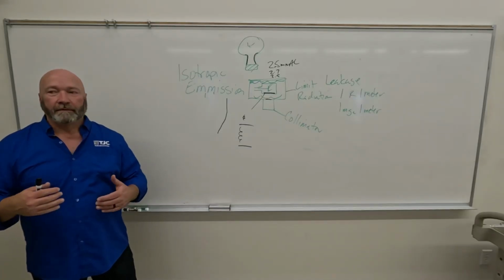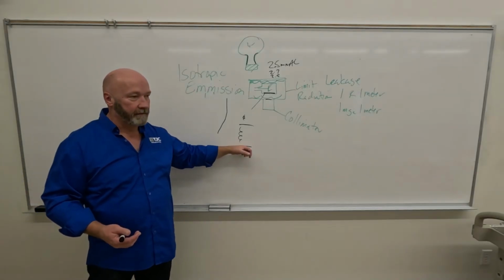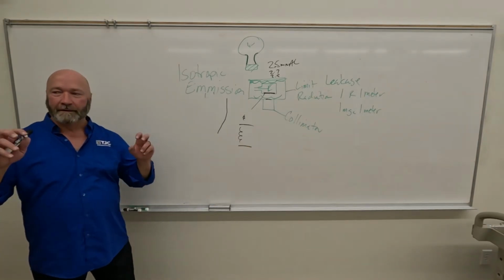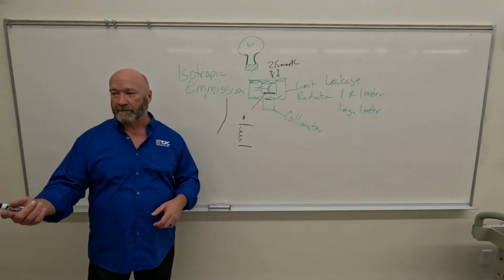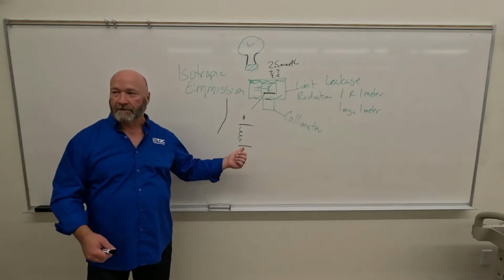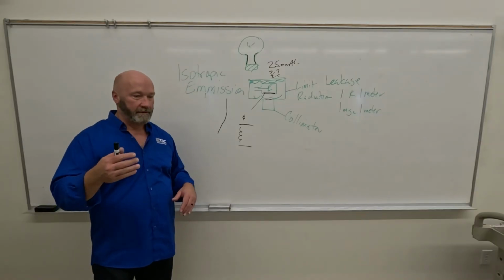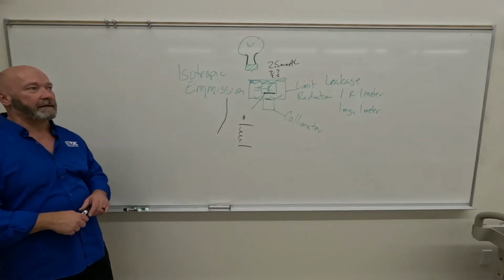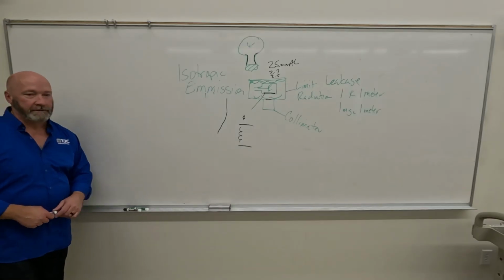So where they put the circuitry that controls the timer is right there on the focusing cup, okay? So when he says in grid controlled tubes, the focusing cup becomes the exposure switch, that's what he's referring to. Doesn't mean you reach inside the X-ray tube and hit that button. It's just that's where that circuitry controls the starting and stopping, what we refer to as the interrogation and extinction of exposure, at the focusing cup.